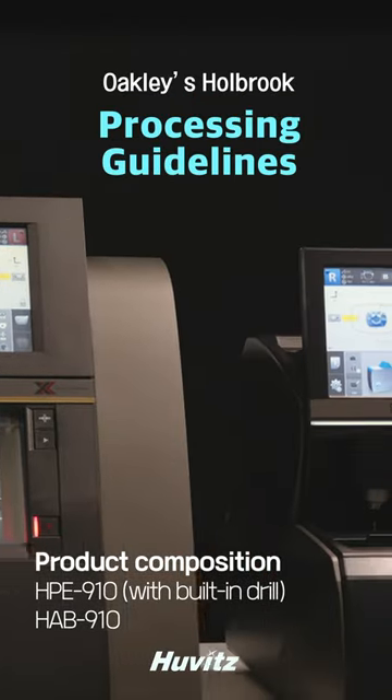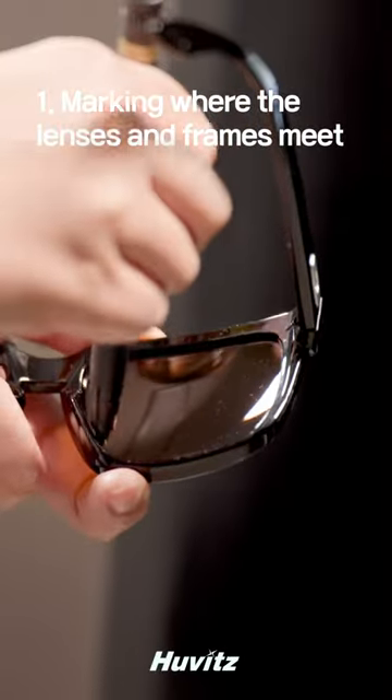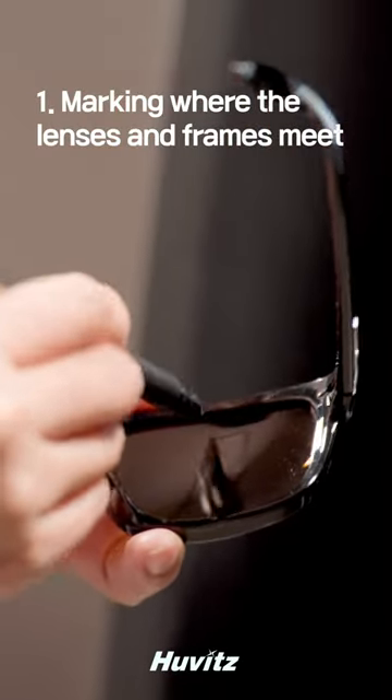For Oakley's Holbrook, let's make it right with HPE-910 and HAB-910. With the demo lens inserted, draw the area where the lens meets the frame with a water-repellent pen.